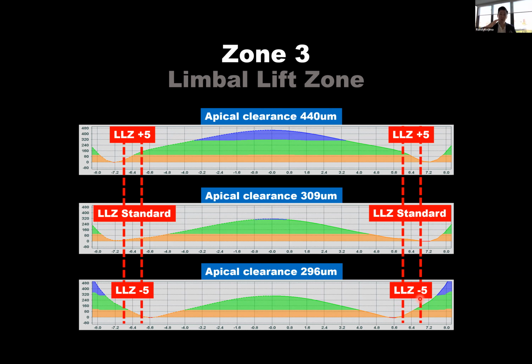There's so much room underneath the contact lens at the limbus that the conjunctival tissue gets pulled underneath that area of large vault where you have a tear suction force pulling on the tissue. So you can reduce the vault to reduce that suction force and that space for the lens to be pulled into.